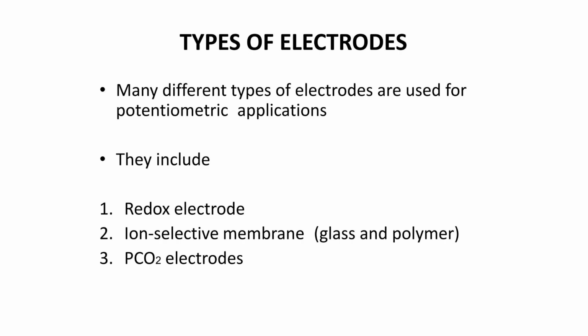Finally, these types of electrodes are used in clinical applications where they allow near instantaneous tracking of essential physiological electrolytes. Today these individual micro electrodes are being packed into cartridges, enabling point of care testing units to calculate a patient's full metabolic electrolyte profile within seconds from just a single drop of whole blood right at the bedside. So these electrodes are mainly used for potentiometric applications.